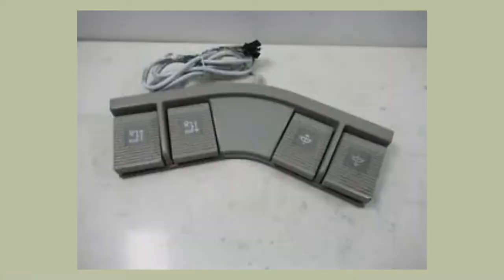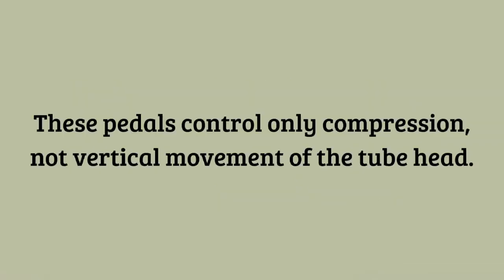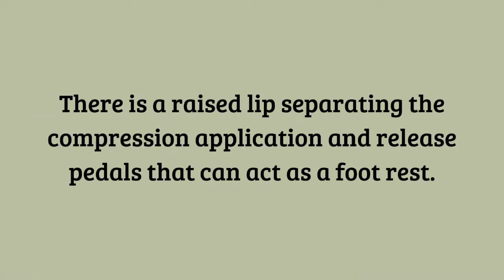Next are the foot pedals. The design of the foot pedals differs radically from one unit to the next. These are low-set, lightweight, and small, which limits ankle flexion during operation and makes them easy to reposition around the unit. These pedals control only compression, not vertical movement of the tube head. There is a raised lip separating the compression application and release pedals that can act as a footrest.